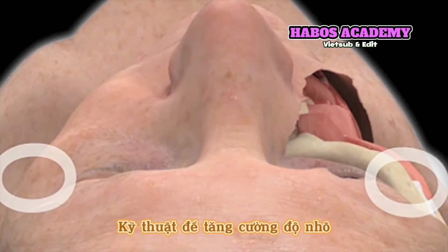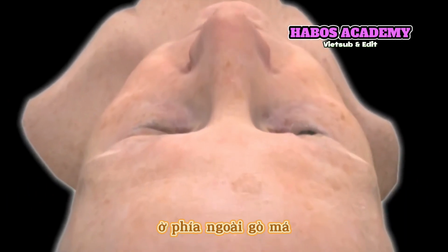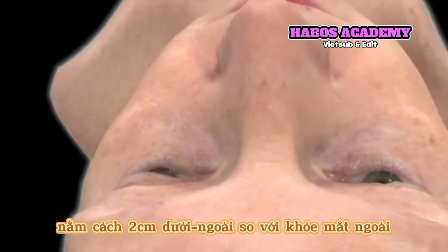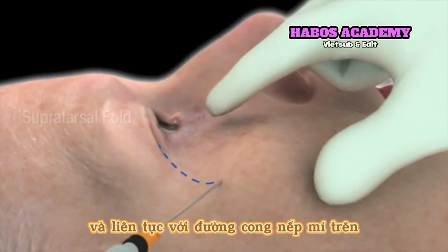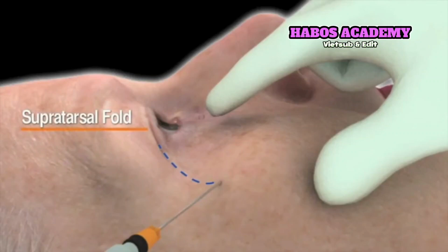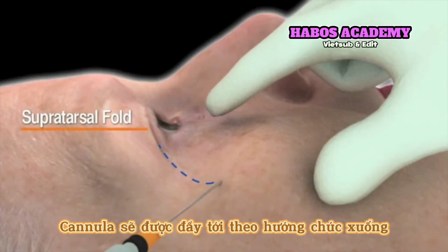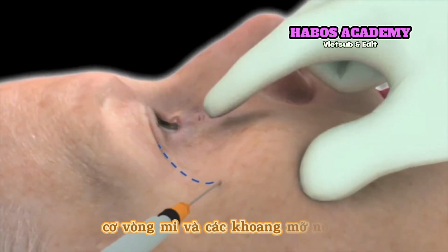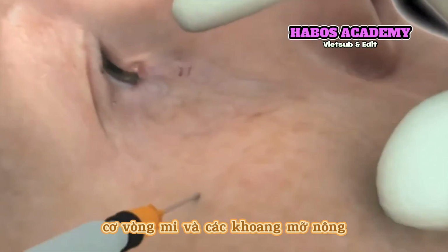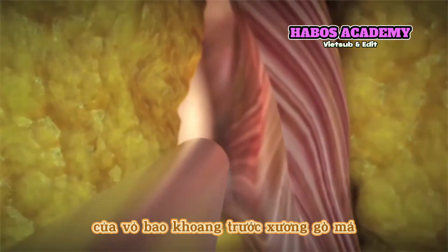The technique for increased projection is performed through the lateral cheek insertion port, positioned 2 cm inferior lateral to the lateral canthus and in line with the supratarsal fold. The cannula is advanced in a steep, downward fashion while performing a pinch and pull technique of the orbicularis and superficial compartments. Resistance will be felt at the prezygomatic capsule.